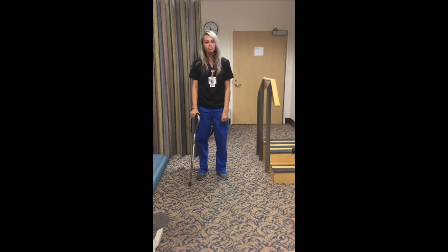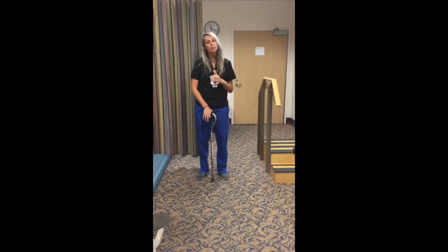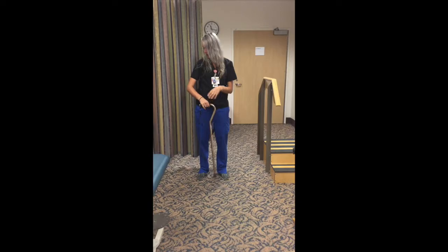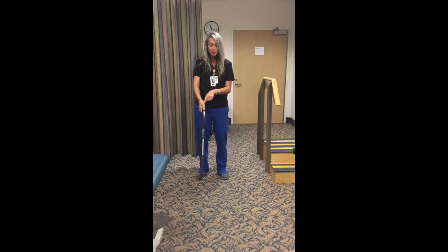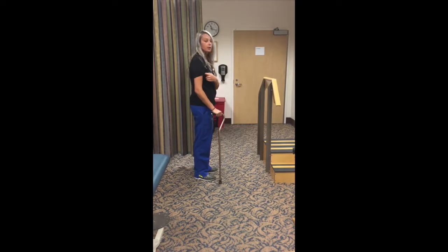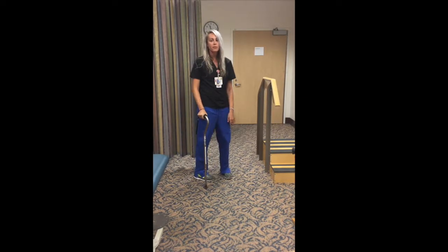Okay, so, and 2 questions, very detailed, just about what's the right height for the cane? So the height for the cane and the walker, in theory, they should be the same height. So it's based on basically 2 things. It's going to be based on your leg height and your arm height. You're looking for a 30-degree bend in the elbow. So for most people, that's around the wrist joint area. If you're looking at wrist joint, on me, it's my wrist joint, so that you have a nice 30-degree bend in the elbow. Okay? If you have really long arms or if you have shorter arms, you may need to go to like your hip bone so that you still get enough support there. So it varies slightly from person to person.